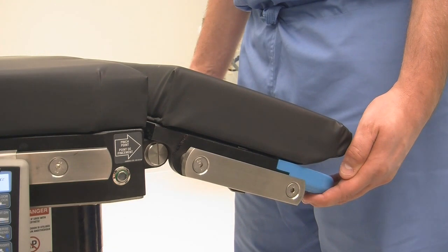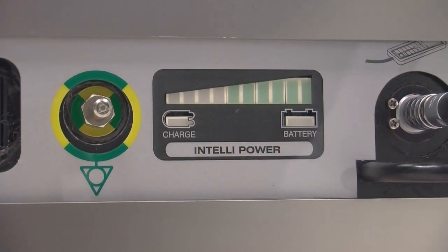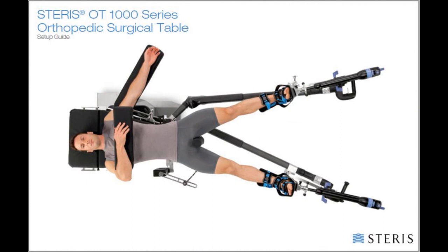First, ensure head section is level. Next, verify table batteries are charged and table is on. If the patient is on the table, ensure the patient is properly positioned. For additional information, refer to the OT1000 series setup guide.